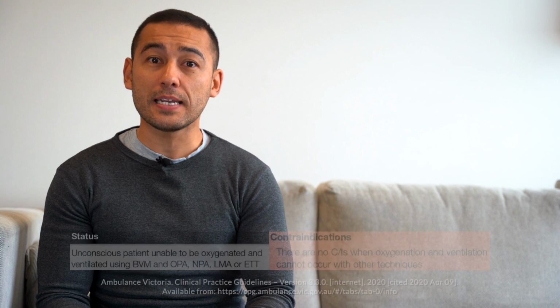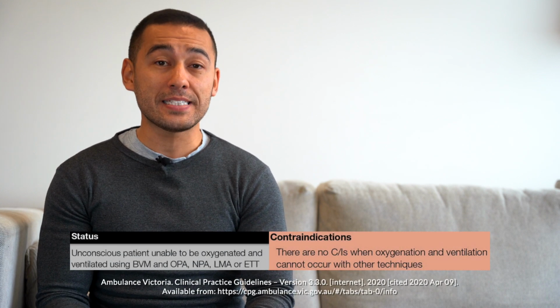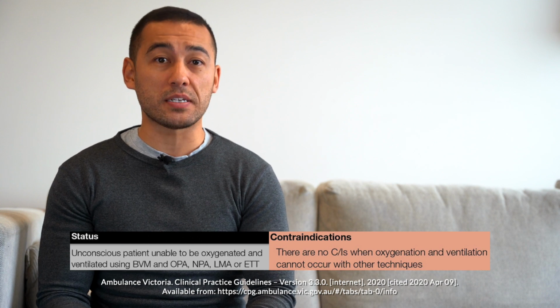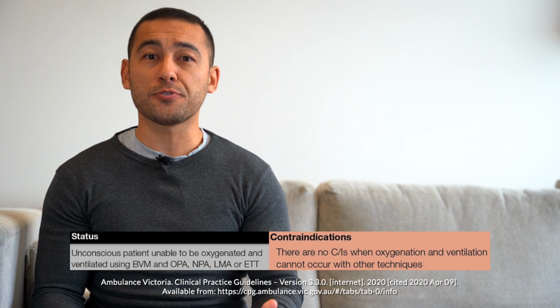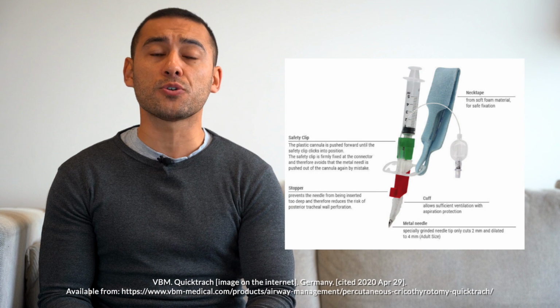Obtaining front of neck access via cricothyroidotomy is indicated in patients who cannot be ventilated and oxygenated using an ETT, BVM, or supraglottic airway device. There are no contraindications in such circumstances. In Ambulance Victoria, a cricothyroidotomy is performed using the Quick-Trach 2 device.